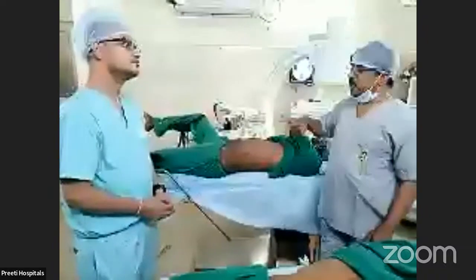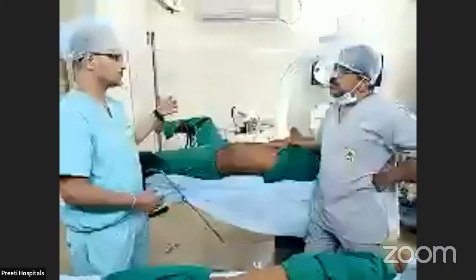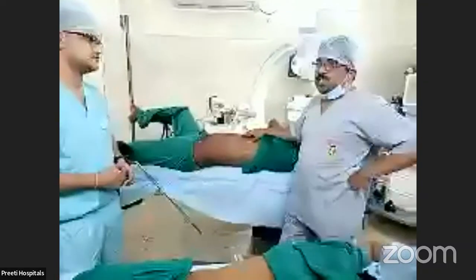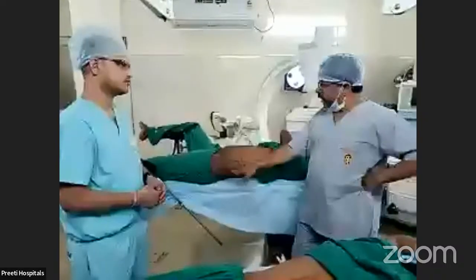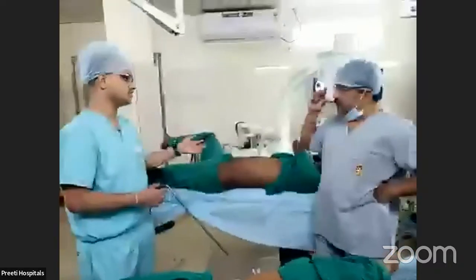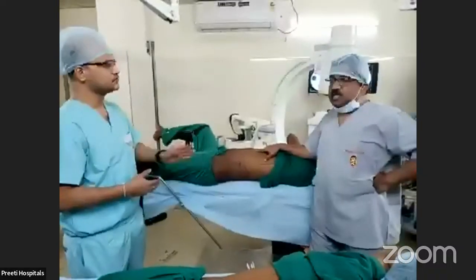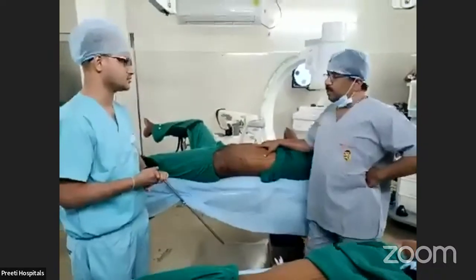So ECRS, supine PCNL, apart from the stone location, where do you prefer? If the patient is having any cardiorespiratory problem, see, every patient cannot be turned back easily. A 150 kg patient is there, severe breathlessness is there, airway control is very difficult. If somebody can do it from the supine, it is better. Next, emphysematous pyelonephritis patient with destabilized cardiac status, low BP, we can do supine puncture, PCNL we can do.